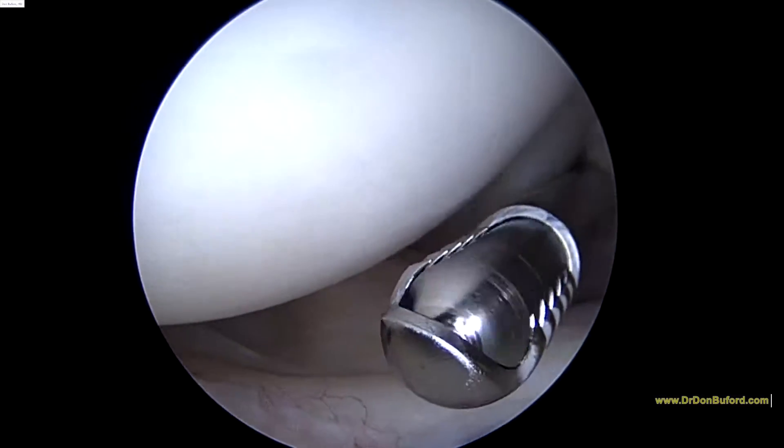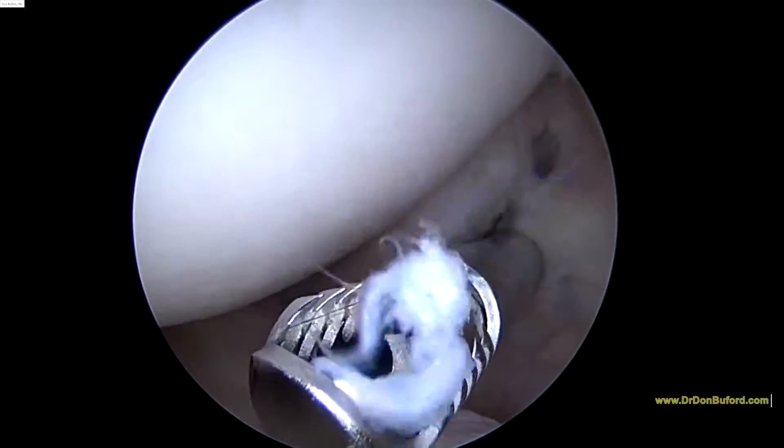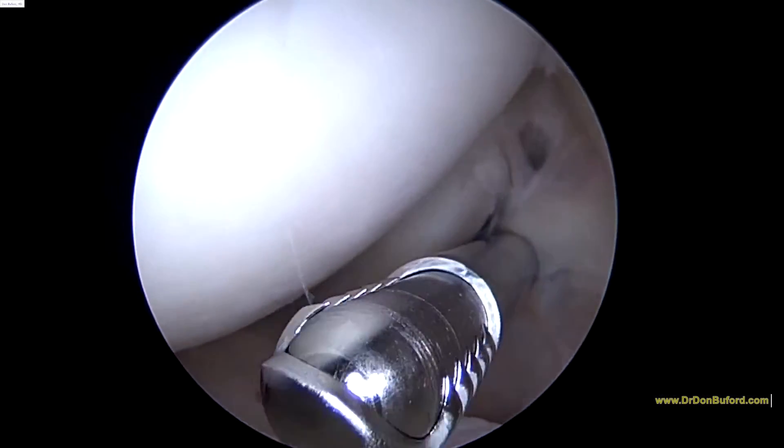We're going to look around inside the joint a little bit longer. If there's anything else significant, we'll come back up on the video. Otherwise, the next thing we look at will be in the subacromial space.